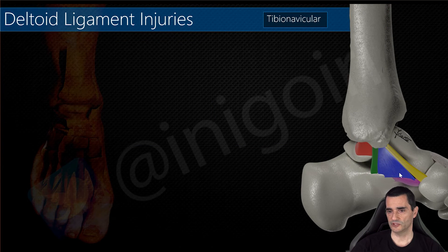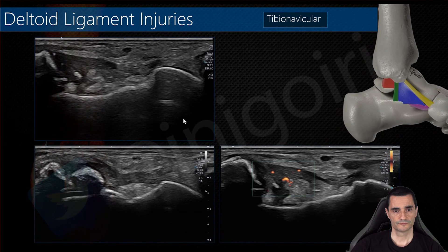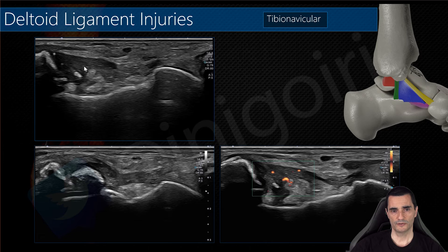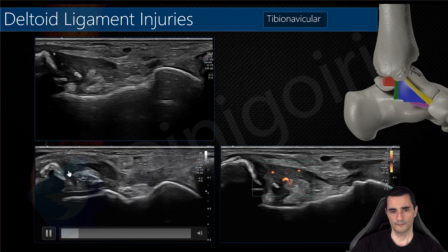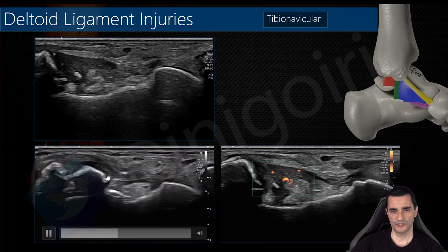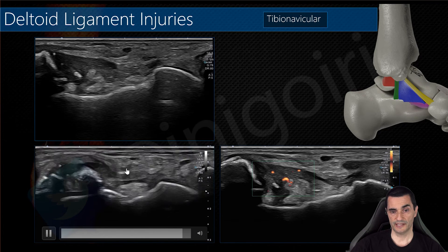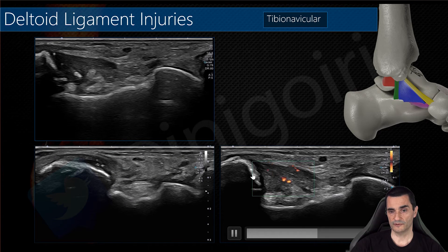Just anterior to the tibio-spring is the tibionavicular ligament. Here the tibia is visible, this is the head of the talus, and this is the shadow of the navicular bone with the end of the spring ligament. You can see this hypoechoic thickening of the tibionavicular ligament with, in this case, a bony avulsion — a large avulsion of more than a centimeter — and edema in this tibionavicular component with Doppler signal inside.